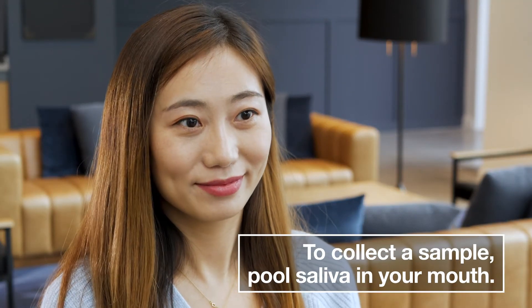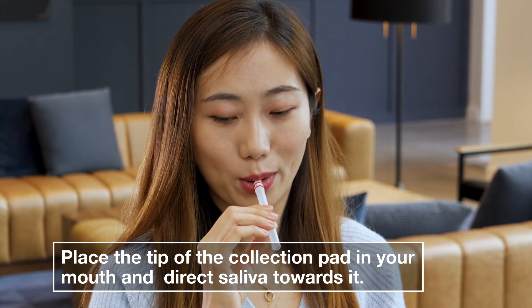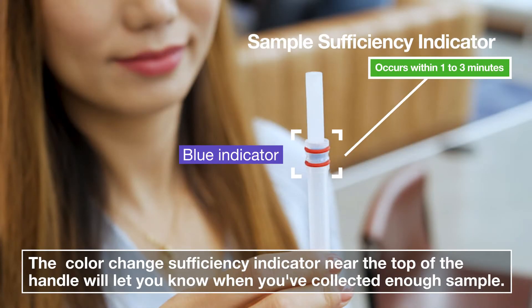To collect a sample, pool saliva in your mouth. Remove the cap to expose the collection pad. Place the tip of the collection pad in your mouth and direct saliva towards it. The color change sufficiency indicator near the top of the handle will let you know when you've collected enough sample.